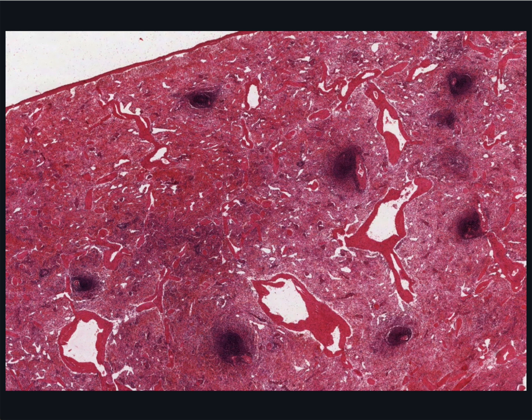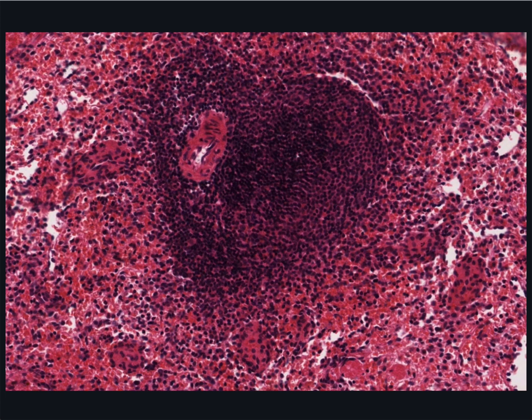Now observe this island of white pulp at much higher magnification. In 3 dimensions, the white pulp has a geometry of a branching tree surrounding branching central arteries. In fact, the white pulp can be thought of as part of these arteries. It's their tunica adventitia, but composed of lymphocyte-laden reticular tissue instead of the usual ordinary dense connective tissue you'd see in a normal blood vessel.